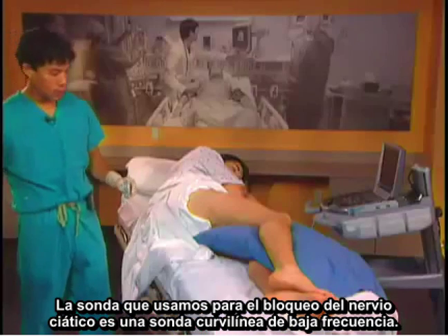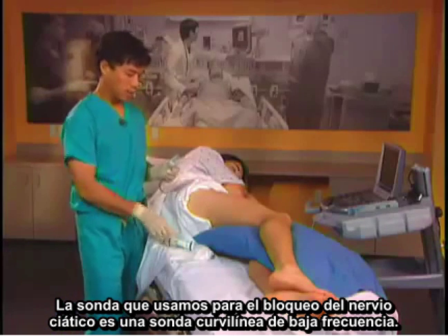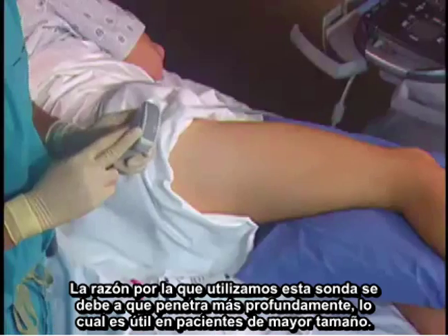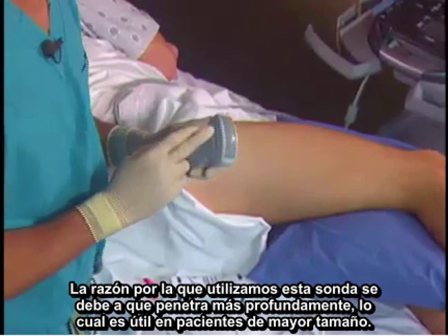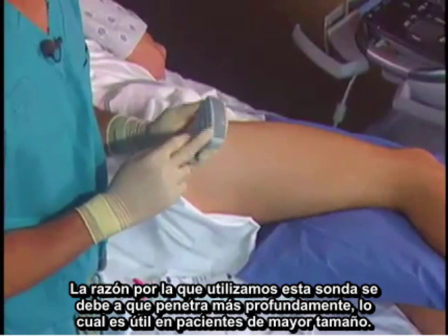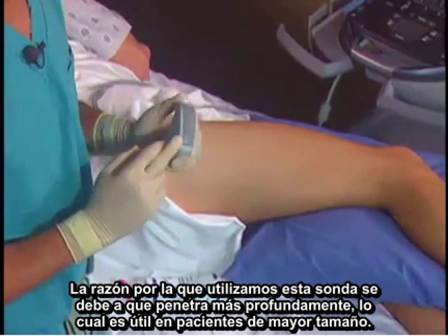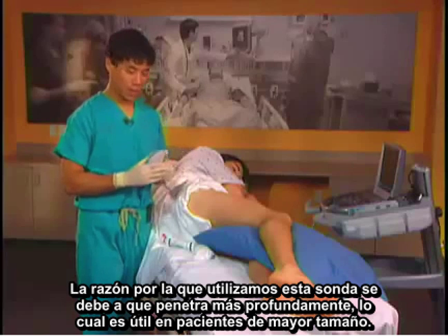The probe we use for a sciatic nerve block is a curvilinear low frequency probe. The reason we use this probe is because it penetrates deeper, and this is useful in larger patients.